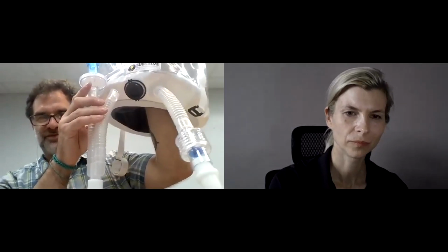Yeah. Nice. So inspiratory side is that Respironics valve, which gives you potentially emergency breathing capability. And then your expiratory side is your backup drainage PEEP valve, and your primary filter and PEEP valve pointed up rather than down. Yeah. So definitely it's going to save the filter. It will last for longer.